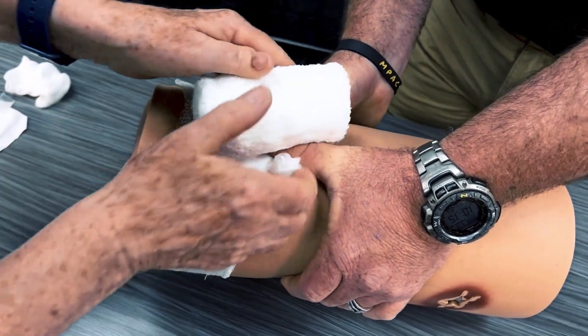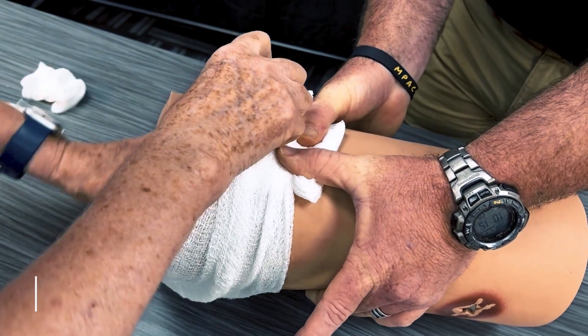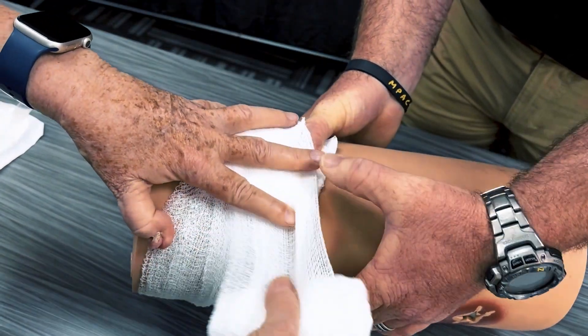Frequently reevaluate the patient and the wound for re-bleeding. Do not remove the bandage unless bleeding continues. If needed, repeat the process to obtain hemorrhage control.